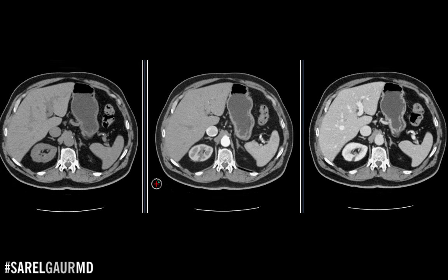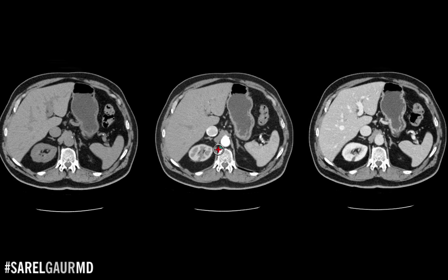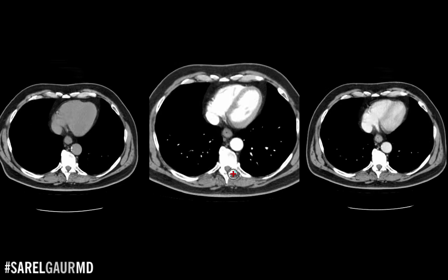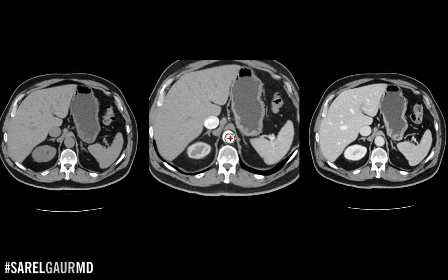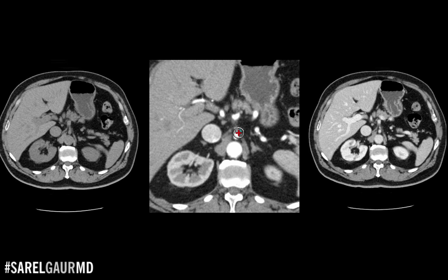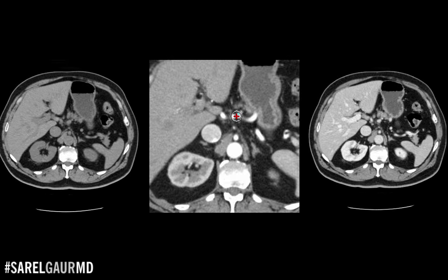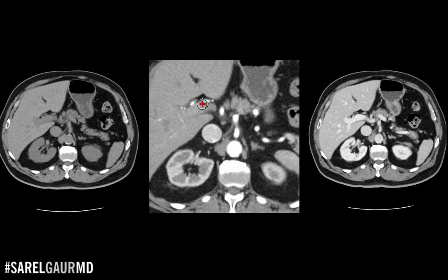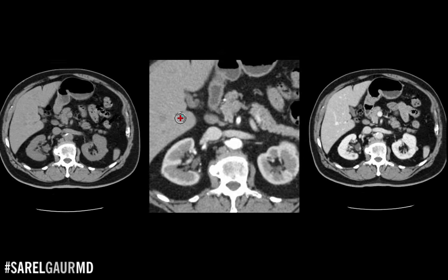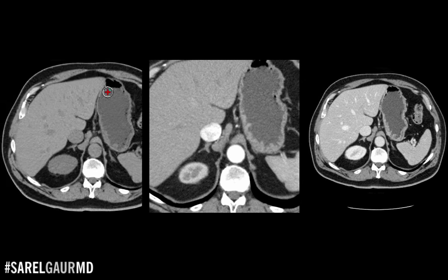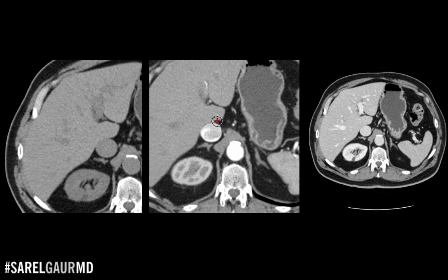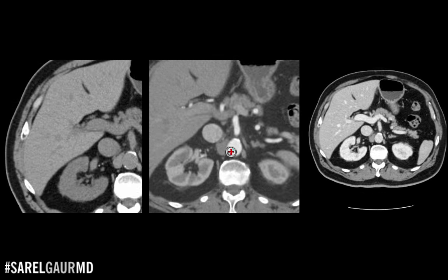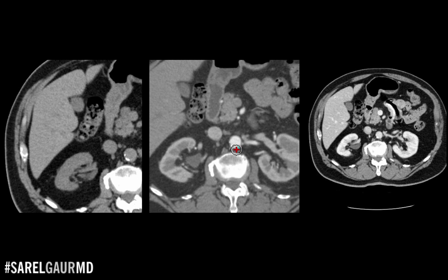This series in the middle is an arterial phase CT. The arterial tree is extremely dense and bright and easy to see — I'm getting really high-quality information about the arterial system structure, which was not present on the non-contrast CT. I could use this structural information to plan a hepatic arterial intervention, or use the contrast in the lumen to screen for vascular diseases like stenosis or a pseudoaneurysm.